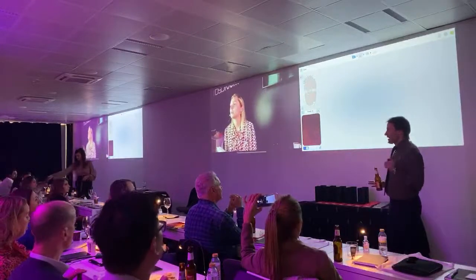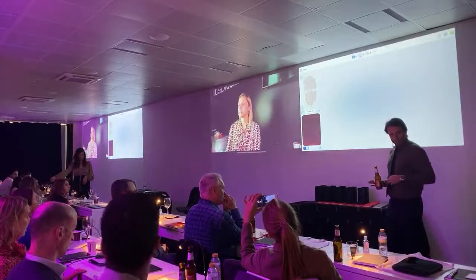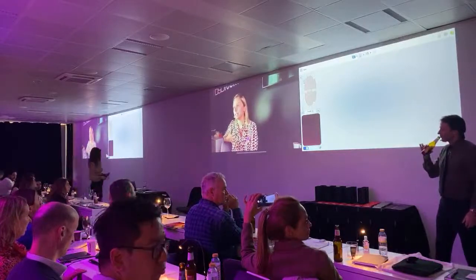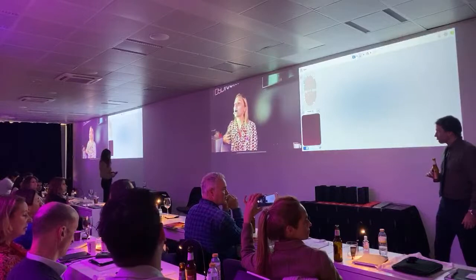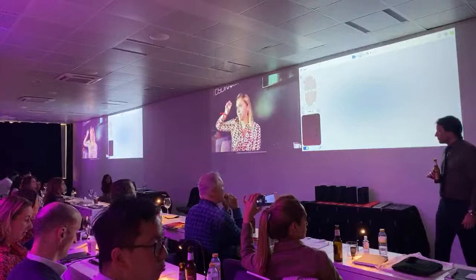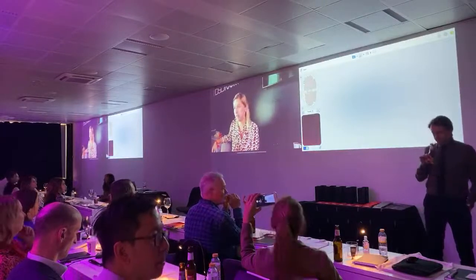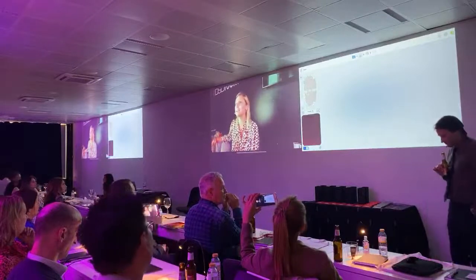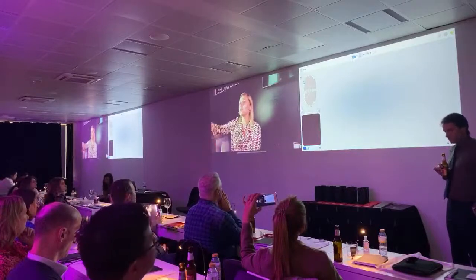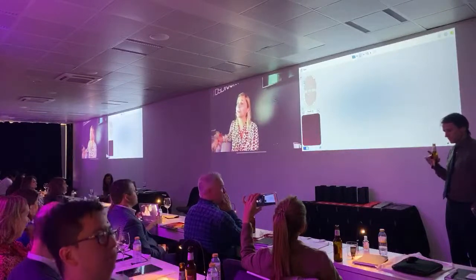We're trained to scan less information rather than more. Yes, but it's the overscanning. It's very valuable. It really takes more time, but as a clinician, if I do a conventional impression, maybe I will do it faster, but it's only apparently faster, because if I make a mistake, I will have to do everything again. Put the cords, wait. In the scanning, I just erase what I did wrong, and then I scan again. But that post-processing time is time that you're investing, you're not losing. So I'm not concerned about this time.